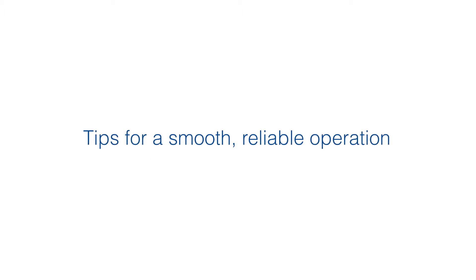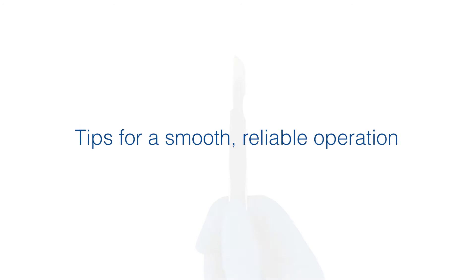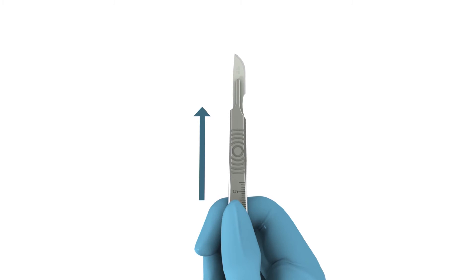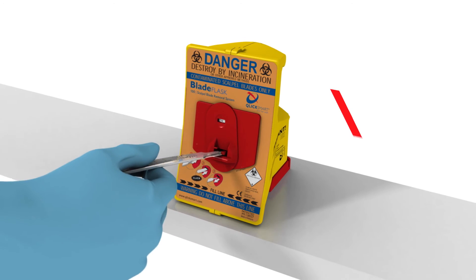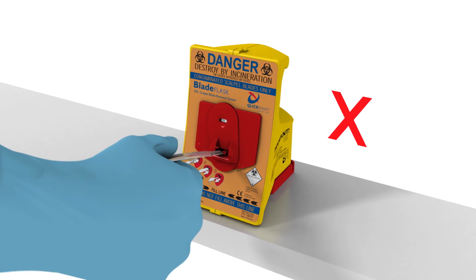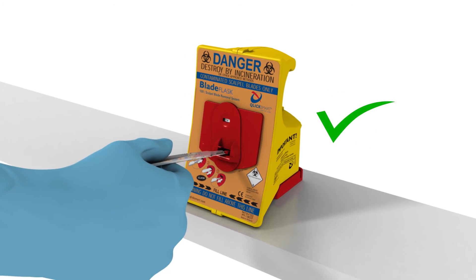Being aware of a few basic tips for the correct usage of the ClickSmart Blade Flask will ensure smooth, reliable operation. When inserting the blade, ensure the scalpel blade faces the correct way. Don't skew the scalpel hand to the left, right, up, or down. Always insert the scalpel in the flat position.